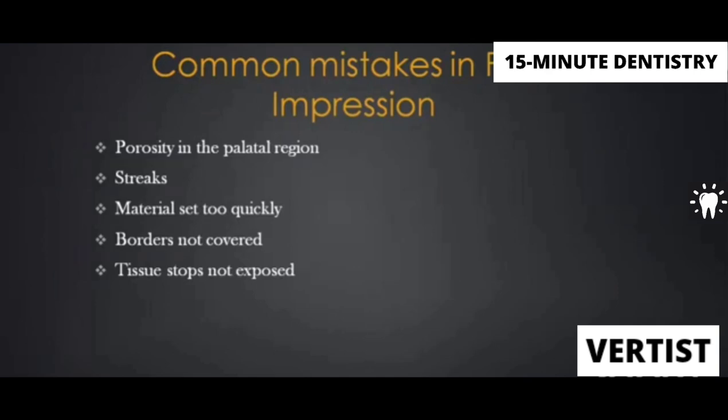Second, you are taking a lot of material. The more material you take, the more time you have to mix. The more time you have to mix, it sets much quickly. So be careful with that. Don't take a lot of material. It is not required. Borders are not covered, so when you are loading, ensure that you cover all the green stick material with your impression material and then place it in the patient's mouth. The borders have to be covered.